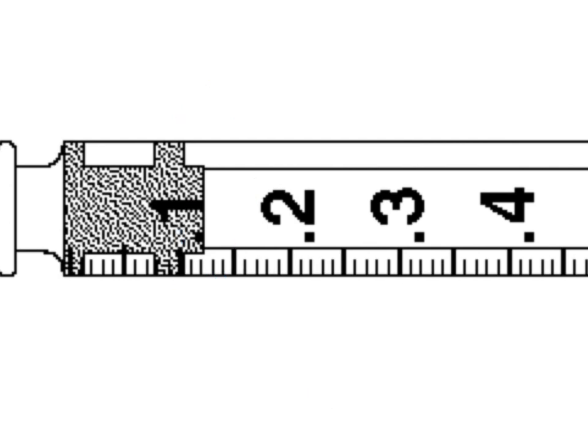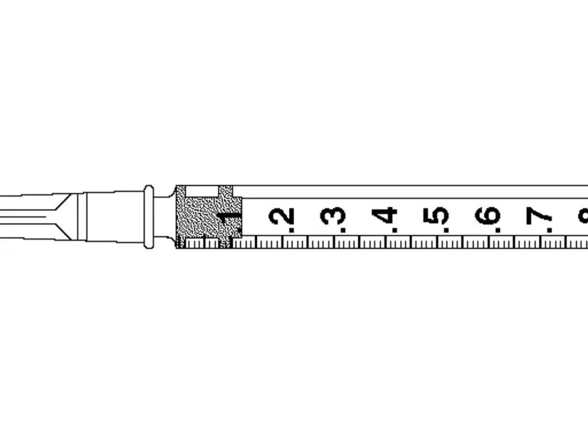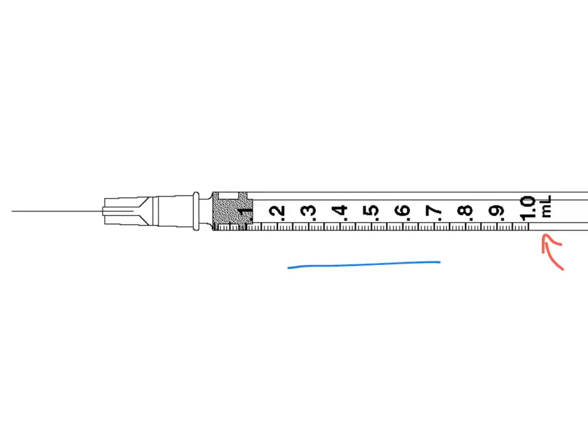So what's going to happen here, if you think about it, needing to administer 0.34. In this case, that means we'll go to the 0.3, and you just simply count 4 lines behind it. Oh, sorry, terrible mark there. That would be 0.34. Like I said, you'll already have it counted off for you, and your answer on your test will have to be to then tell me how much medication is in that syringe. So it makes it a little bit easier. Oops, I meant to move that, not to draw a line there.